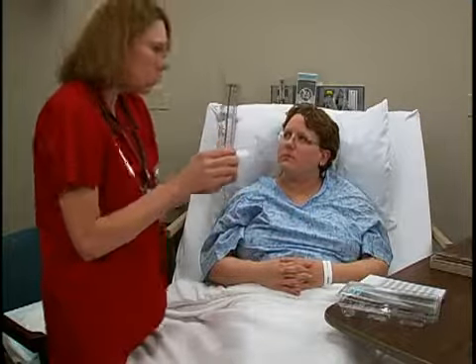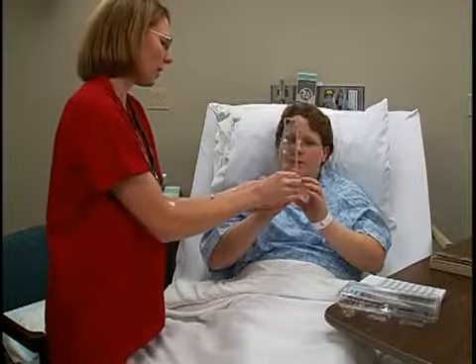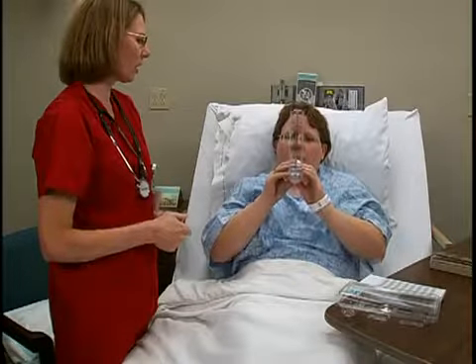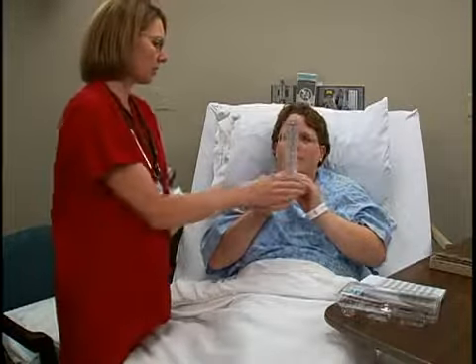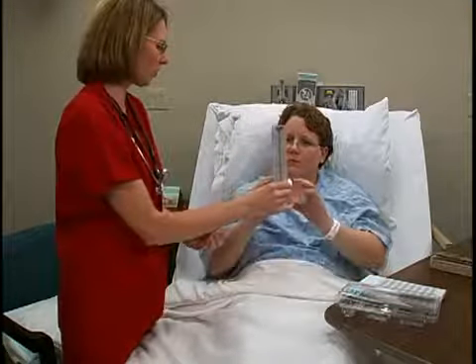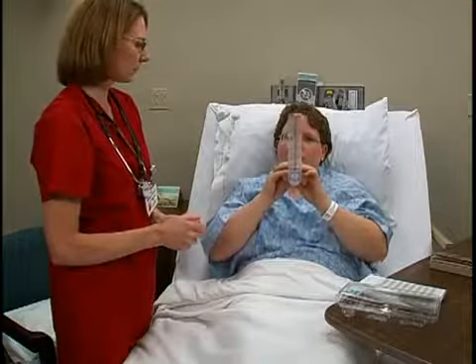Put the mouthpiece in her mouth and have her close her lips, making a firm seal. Don't put your hands on the back of it. Just hold it here. Now have her blow out as hard and as fast as possible through her mouth. Deep breath and blow really hard. Good. Let me see what we got. Check the PEFR measurement and repeat the process 2 more times. Try to get the best one out of 3, recording only the highest number on the patient's chart.